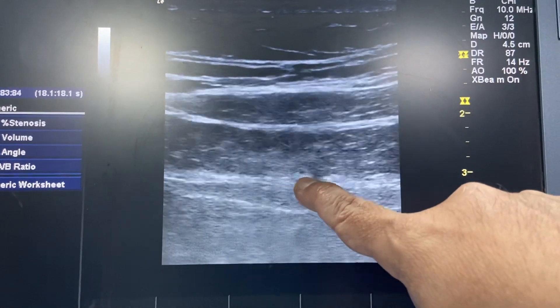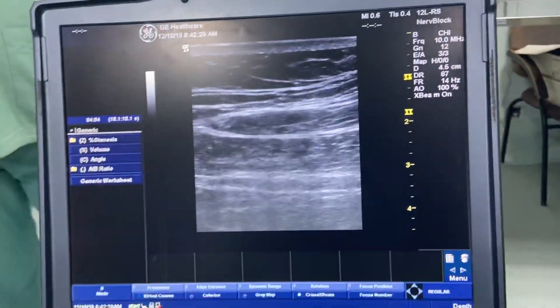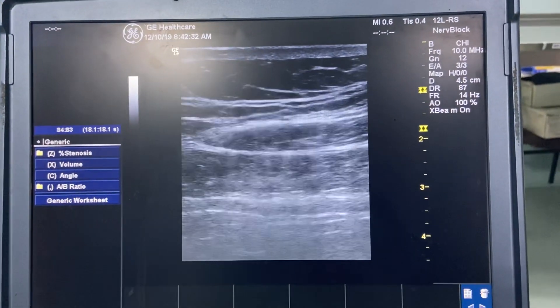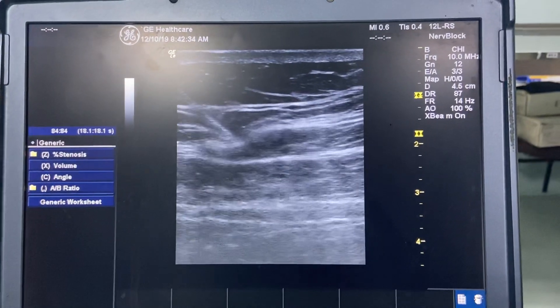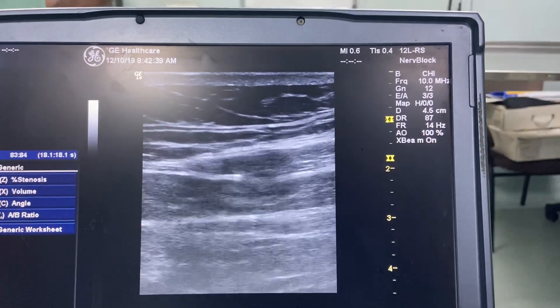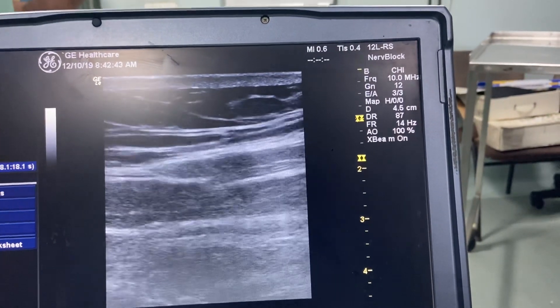We are targeting this area to block. We will start the block procedure. We are inserting a 100mm sonoplex needle. It is coming in-plane from the left side of the screen. You can visualise the needle — it is going through the external oblique muscle.